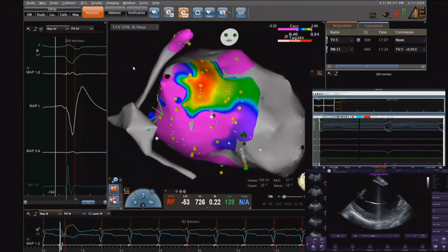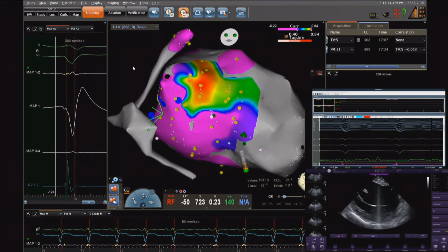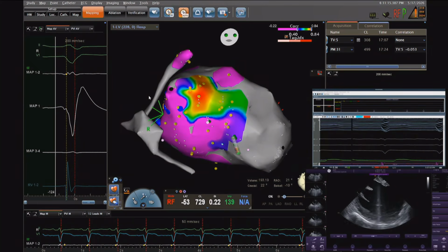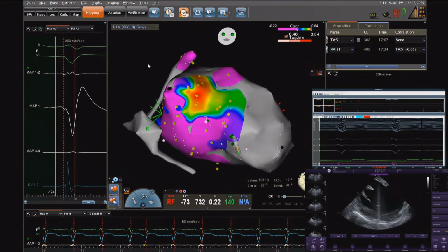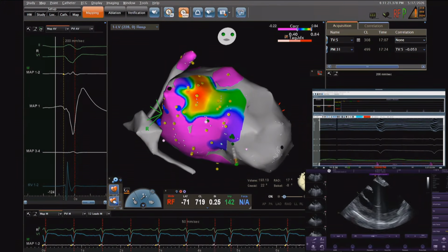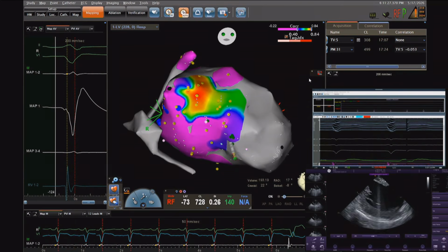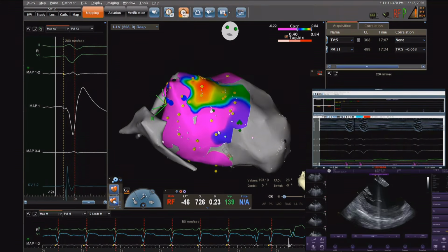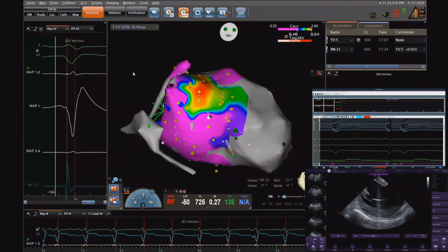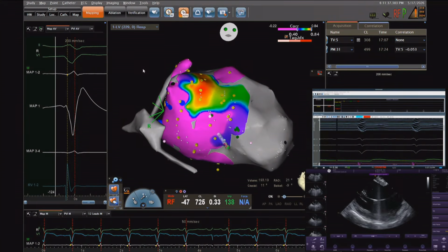We could not get there with the ablation catheter, so we used a sheath to support this micro catheter, and we were close to this takeoff of the anterior vein. But then I tried to push more, and it kicked everything out of the coronary sinus. So we lost this, and there was no good pace map anyway. So it was not helping.